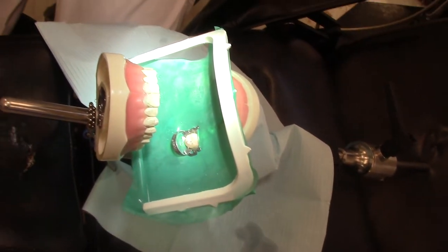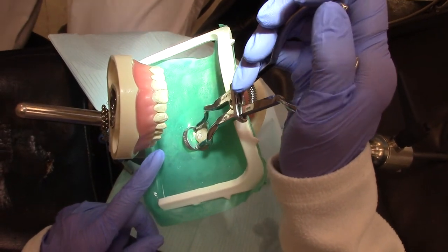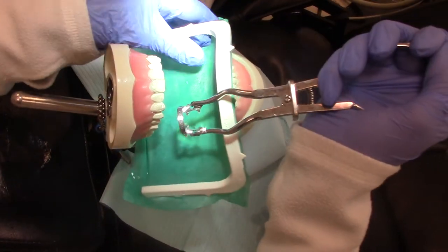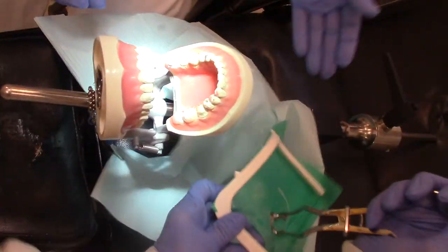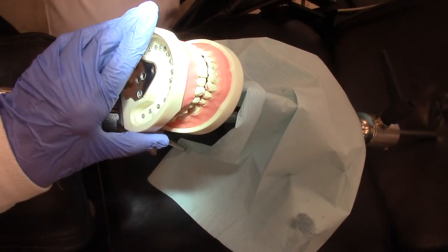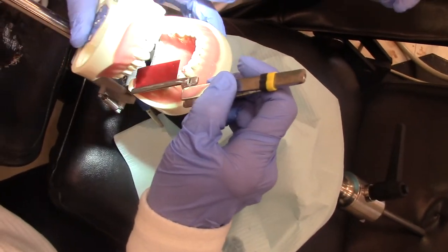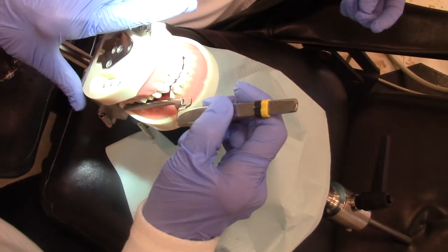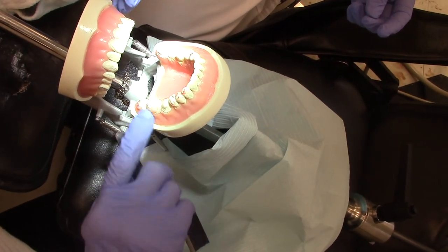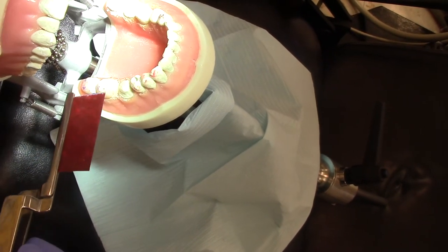Now our endo is completed. The first thing we have to do is take off our rubber dam — fit it, pull it off and out of the patient's mouth. Now that our patient can finally close after about an hour and a half of treatment, we are going to use our articulating paper, have our patient bite down and grind around. You can see that it is a little bit high.